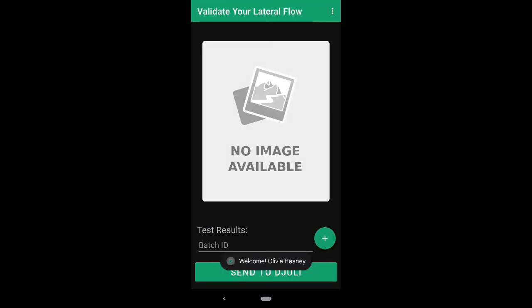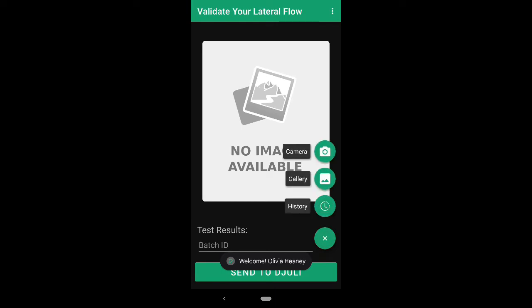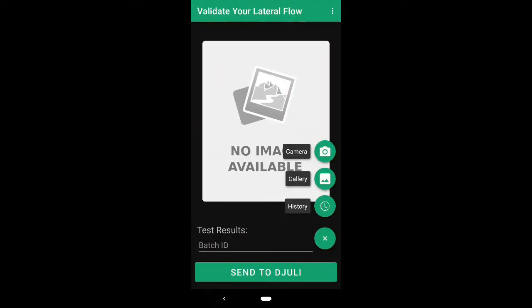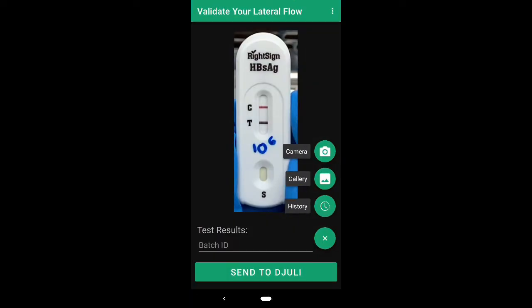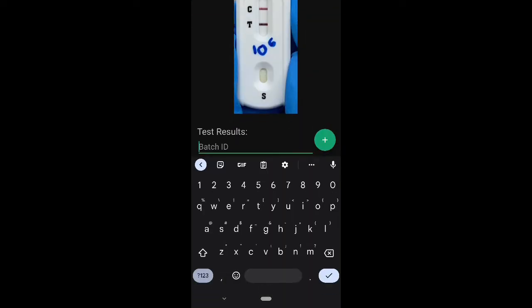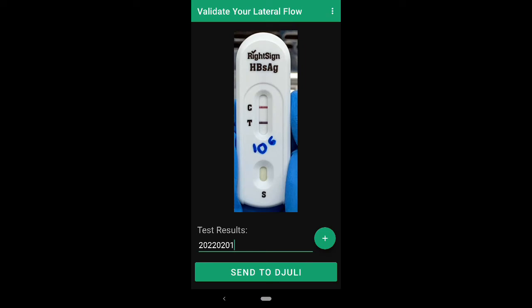Go ahead and add a photo using your camera or choosing one from your gallery. Give the photo an ID such as the date, and then send it to the cloud to be analyzed.